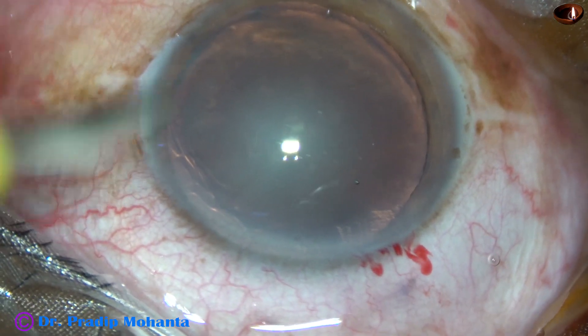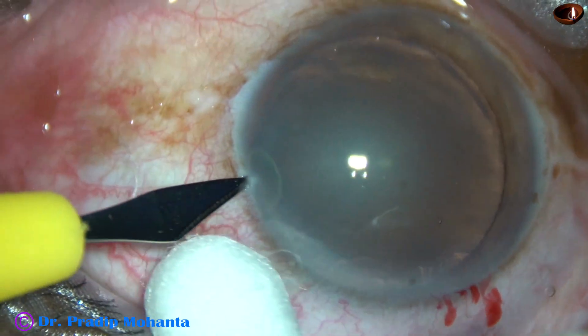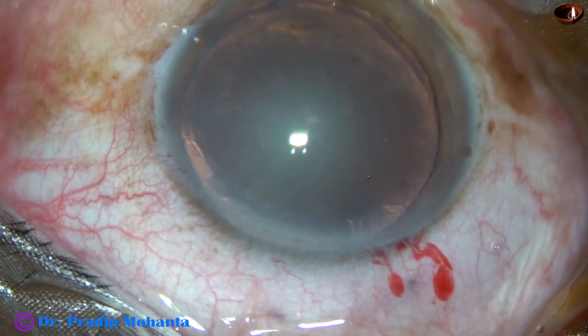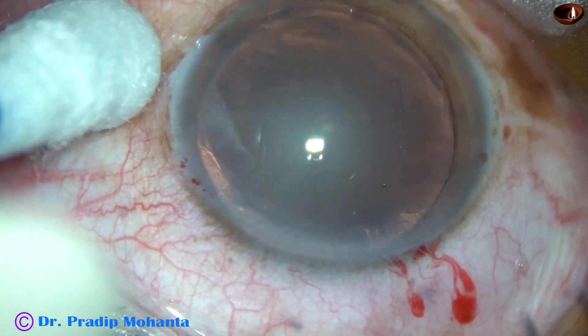And now this is a sideport on the left side of the main incision, about 3 o'clock hours away. In this case, only one sideport has been made.